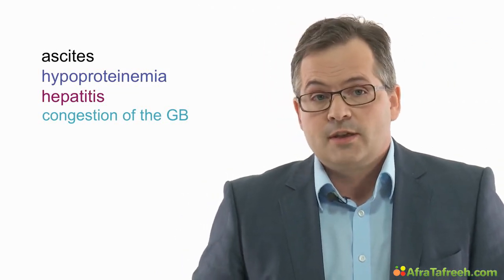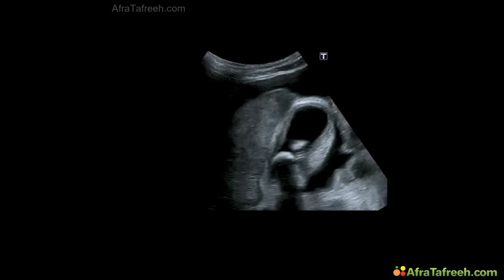Very rarely there's something else than an inflammation when the wall is thicker than 4 millimeters. For instance, ascites, lack of proteins in the blood, or congestion of the gallbladder or hepatitis can be a cause of increased diameter of the wall of the gallbladder. So, like in this scene, the wall is more than 4 millimeters thick. There are 3 layers seen. But what's the difference? There's no positive Murphy sign, so it's no inflammation.